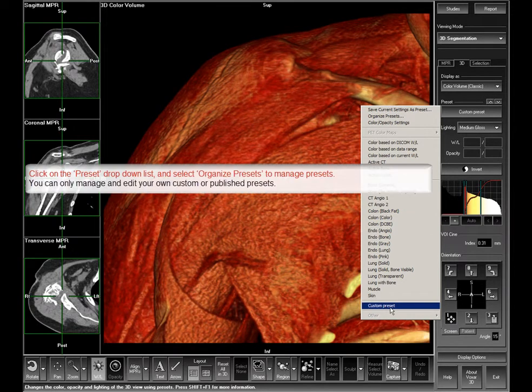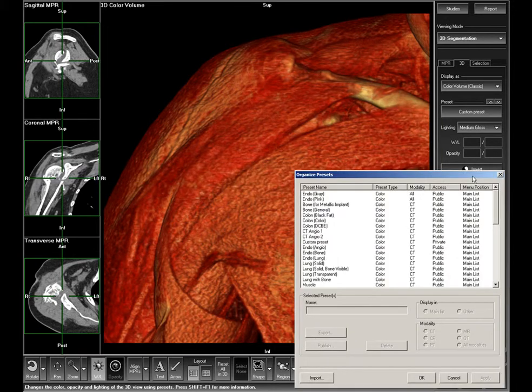If you want to manage your custom presets, click on the preset drop-down list and select Organize presets. A new window will open showing you all public and private presets. The presets marked private are your custom presets and can be managed, while presets marked public cannot be changed.